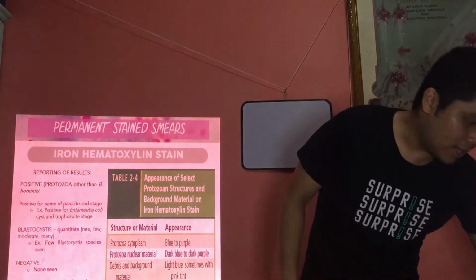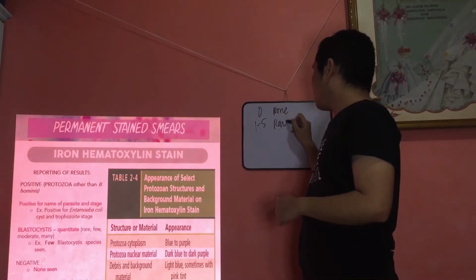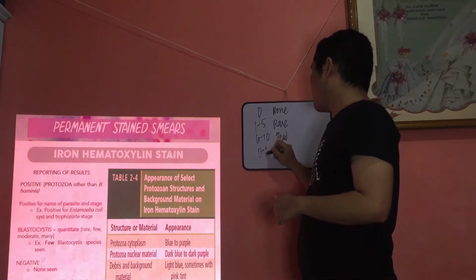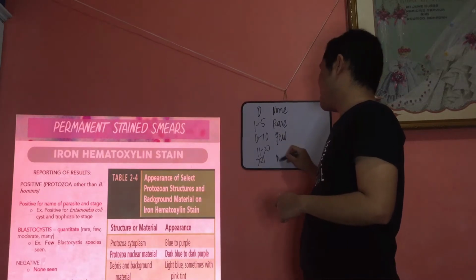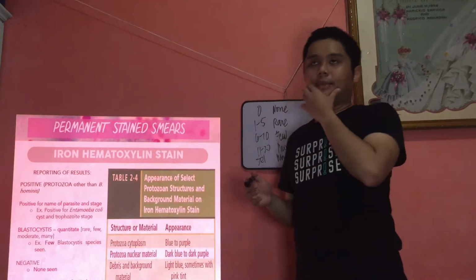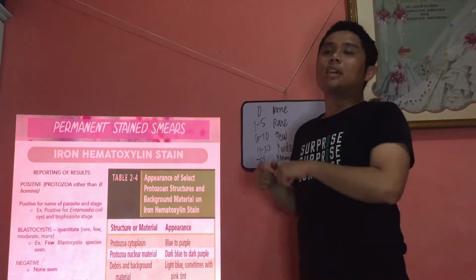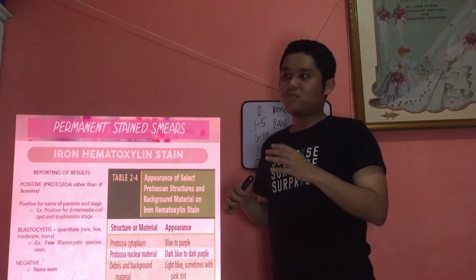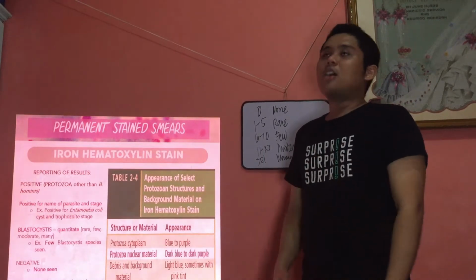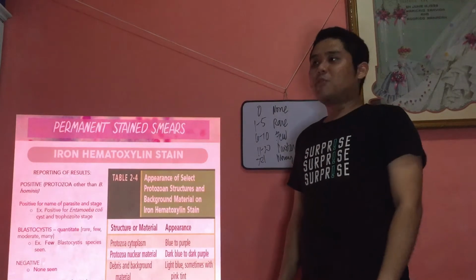Okay, so example, 0 is none seen. Then 1 to 5 is rare, then 6 to 10 is few, then 11 to 20 moderate, greater than 21 is many per field that you see. Alright, so that's just an example. So it's established per laboratory, okay? And I wasn't able to search this in the books for Blastocystis. So we quantitate Blastocystis because, if I'm not mistaken, quantitation will help us determine the severity of infection, if it's really severe, or just light, or just commensal, not really the cause of infection. If I'm not mistaken, for Blastocystis hominis.